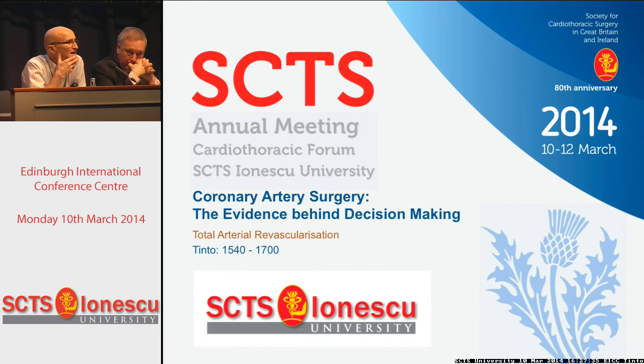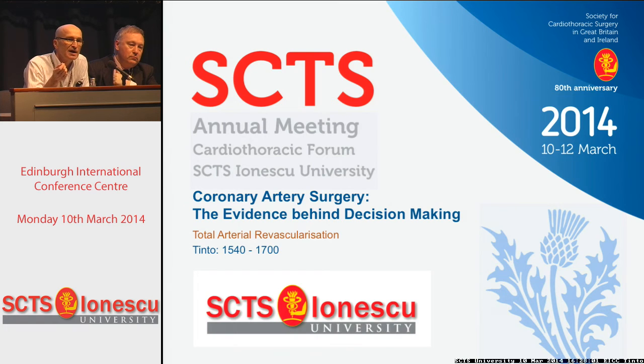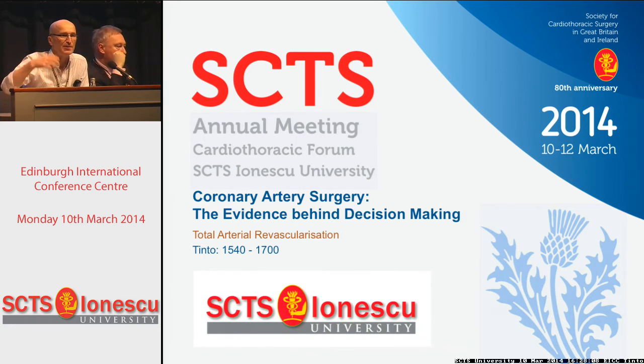But what we reported in JTCVS was that about 1 in 10 grafts had a relatively low flow, a flow less than 20 mils per minute, accompanied by a pulsatility index above 5, so say 7 or 8. And you were then left wondering what to do with this graft because it fell outside the normal criteria. So we ended up revising 1 in 10 grafts. And in the vast majority of these, we couldn't find the problem. So we re-anastomosed it, and then we ended up with the same figures again, and we just said, fine.